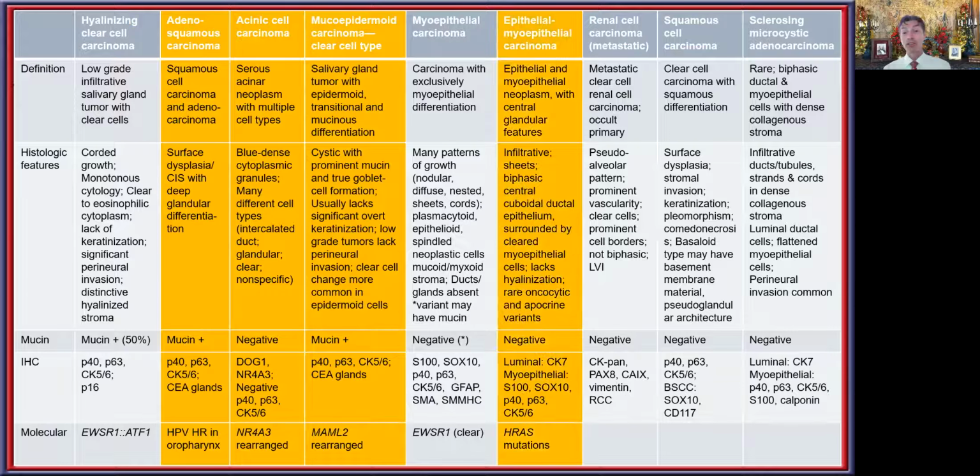One of the important things to consider, and especially when one is dealing with tumors of the oropharynx, although it can occur anywhere within an adenosquamous category, is that cilia can still be identified within the malignancy. And so this is one of the exceptions when you think about cilia in other anatomic sites. We often say, oh, I see cilia, it must be benign, but that is definitely not the case when you're talking about an adenosquamous carcinoma of the upper aerodigestive tract.